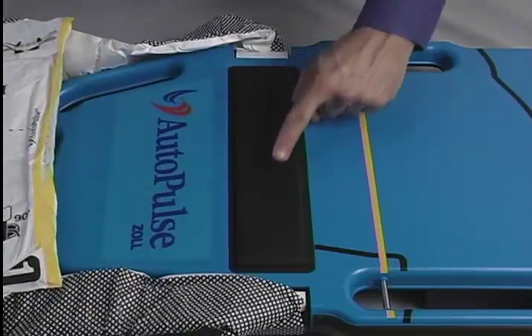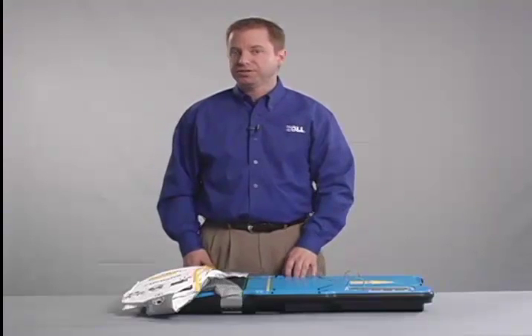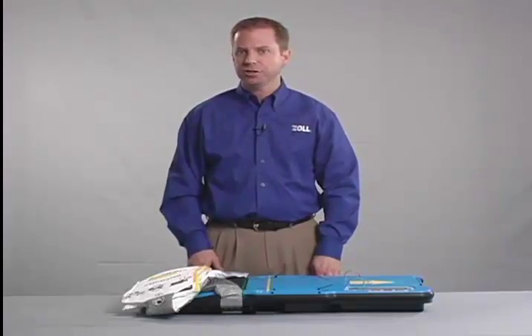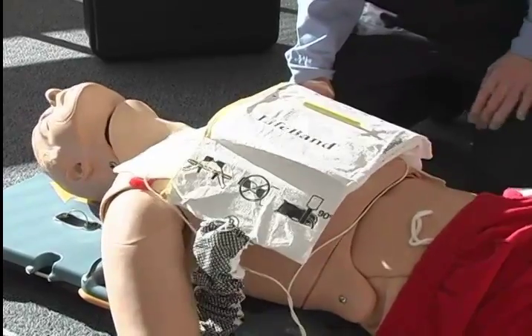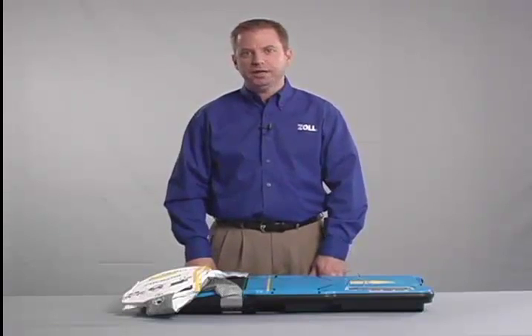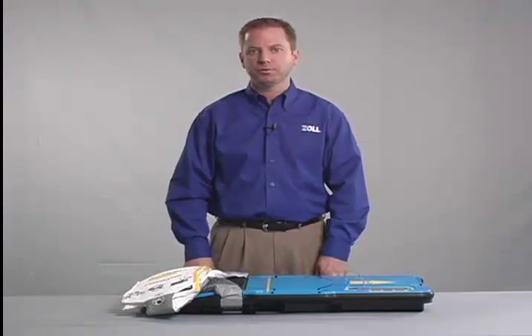The black bar, often referred to as the load cell, is a key component of the compression monitoring system. The load cell initially senses a patient on the Autopulse platform. During patient sizing, the compression monitoring system automatically calculates the chest size, shape, and resistance, then determines the force necessary to compress the chest the prescribed amount. This ensures the Autopulse performs a 20% anterior to posterior sternal compression during active operation. The system continuously monitors the compressions and makes adjustments as necessary.